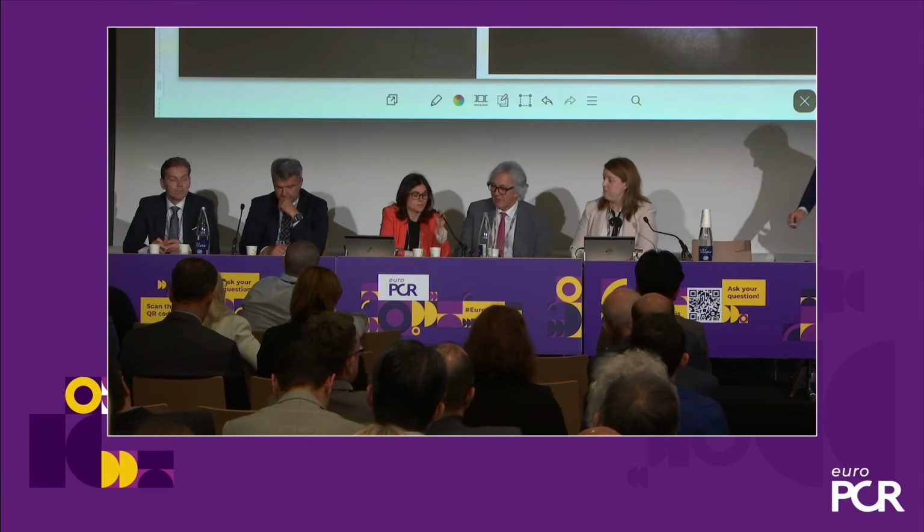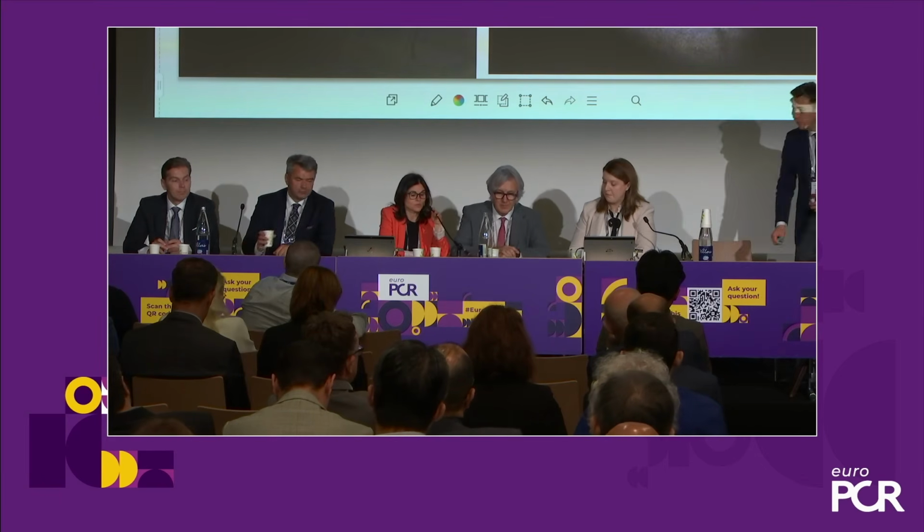Yeah, I think in this type of cases it's important to use all the possible markers you can have. I mean, you've also seen we are always changing the views, looking in different views. The radiopaque markers of the wires are very useful. Every side branch that can be useful, you can wire it and it can help.